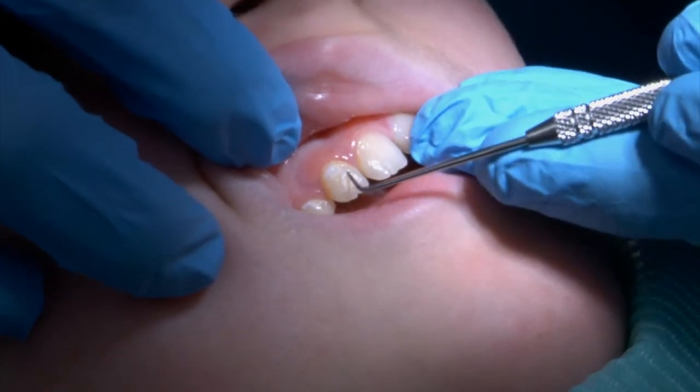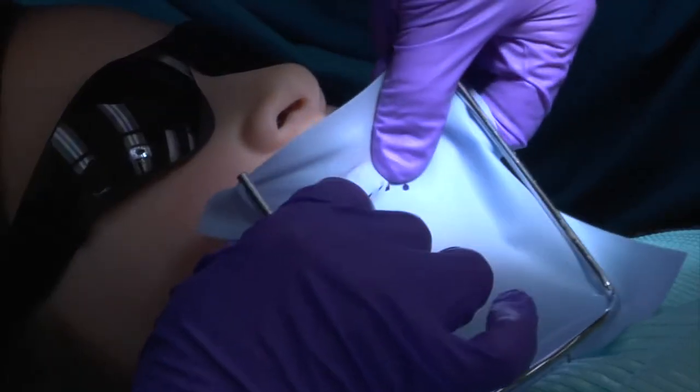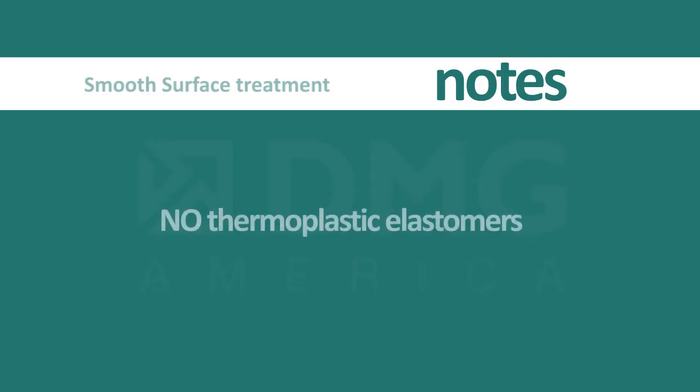To begin treatment of a white spot on a smooth surface, the tooth should be cleaned with pumice and then isolated with a rubber dam. The rubber dam should be well adapted and inverted at the gingival area. Do not use rubber dams made of thermoplastic elastomers such as FlexiDam.